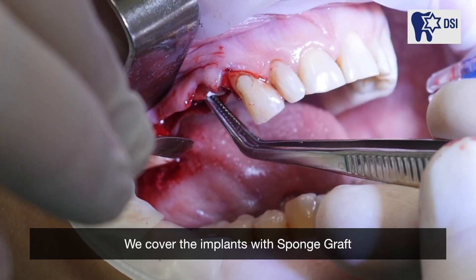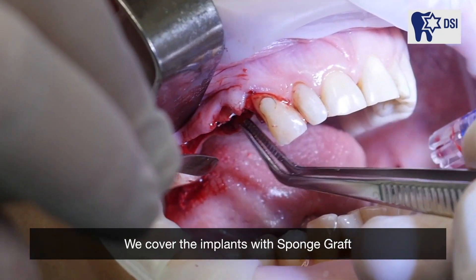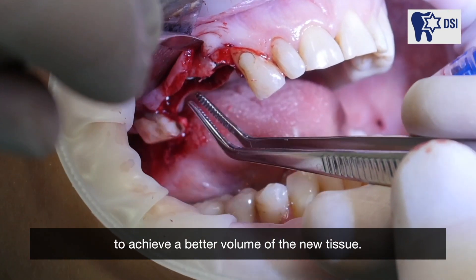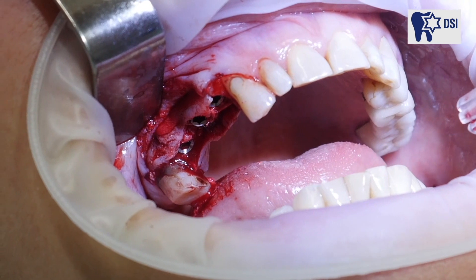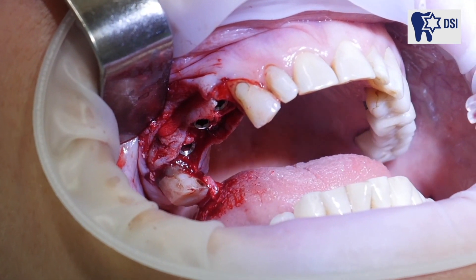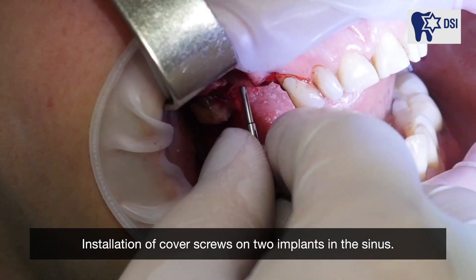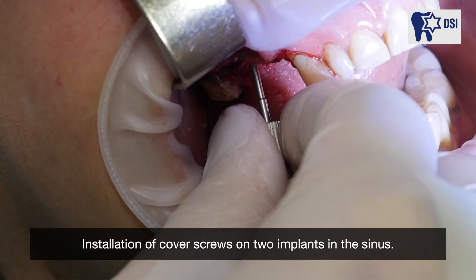We cover the implants with sponge graft to achieve a better volume of new tissue. Installation of cover screws on two implants in the sinus.